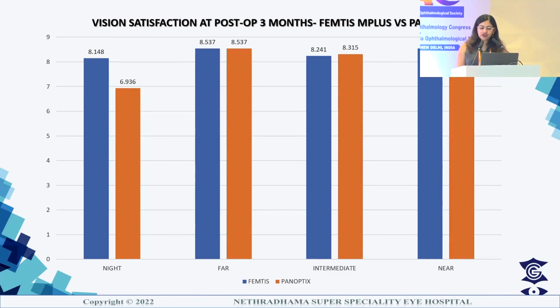And the vision satisfaction score at post-op 3 months showed that the Femtis M+ group scored slightly better, significantly better in terms of night vision, while the Panoptix group scored slightly better in terms of intermediate vision.